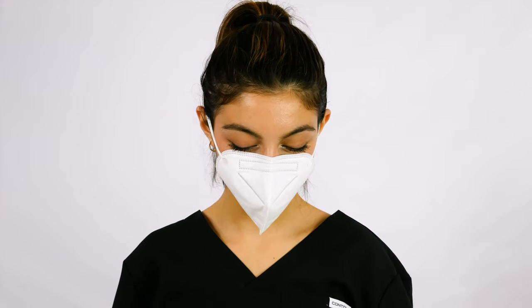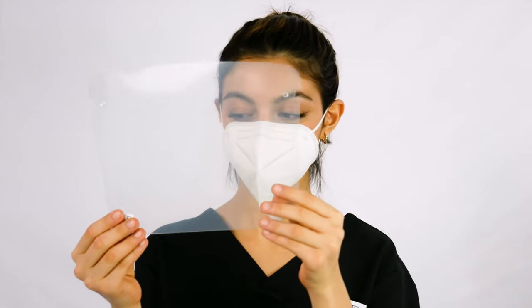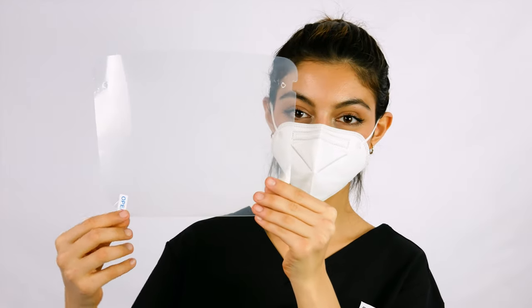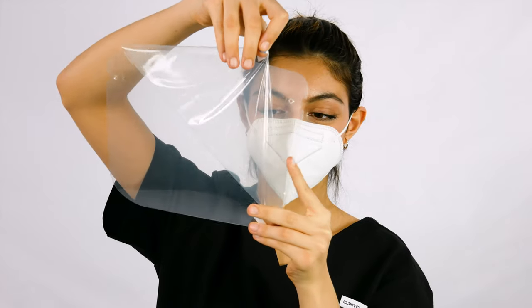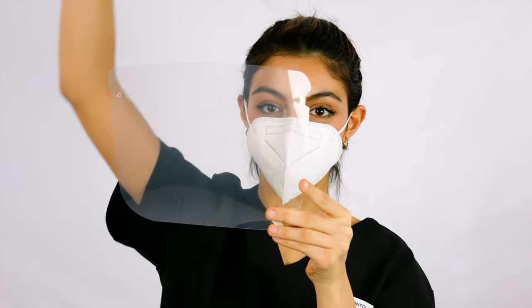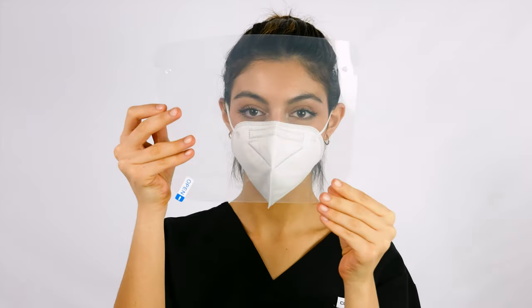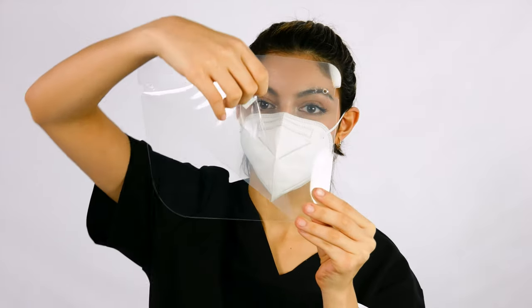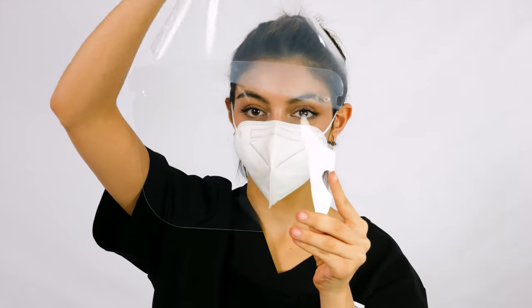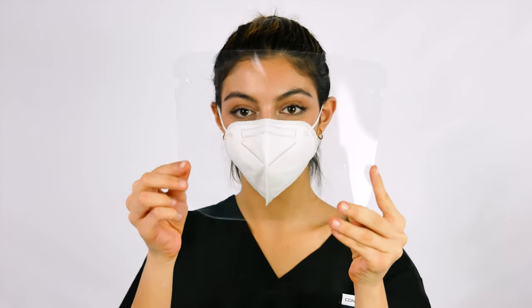First, hold the face shield with both hands. You can use gloves to prevent smudges or fingerprint marks if you wish. Remove the protective film from one side of the face shield starting from the corner. Take care not to damage or scratch the shield. Remove the protective film from the other side of the face shield. If you still notice a foggy or blurry look on the shield, that means that you have not removed the film.